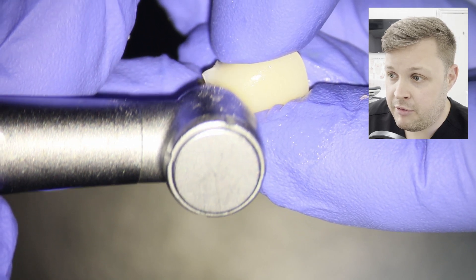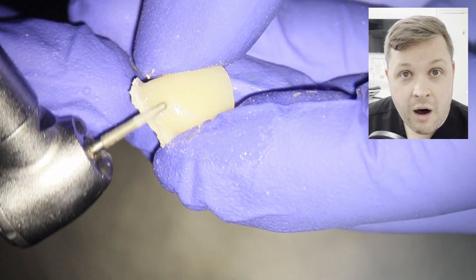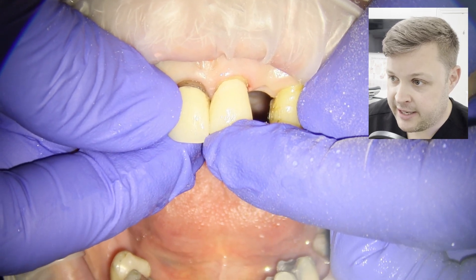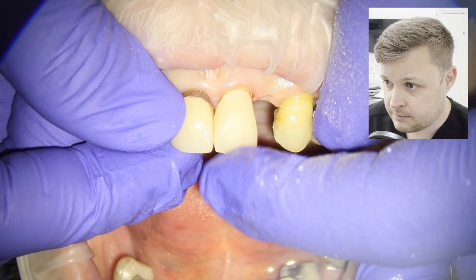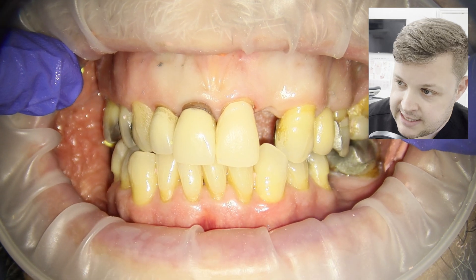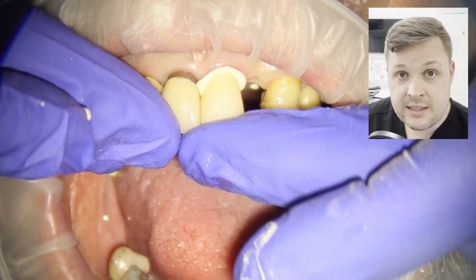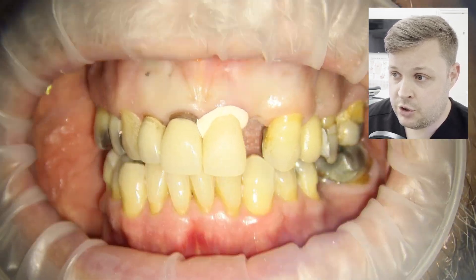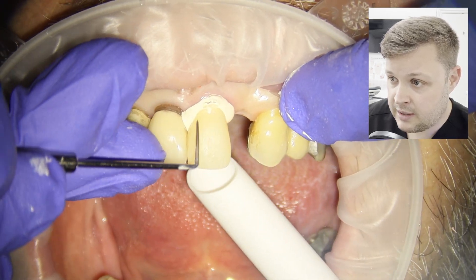Next we're going to prepare the outside of the temporary crown just to clean it up a little bit. I do this with the water off, otherwise it'll go everywhere. Then we try it in the mouth to see if it fits nicely, and we also get the patient to bite together to confirm the fit — and it does fit nicely. Then we just cement it on with standard temp bond, wait for it to fully set, and remove the excess with a probe and a little bit of floss.